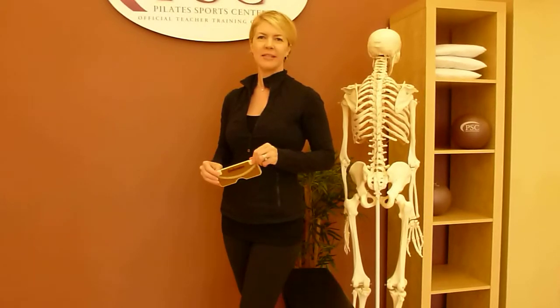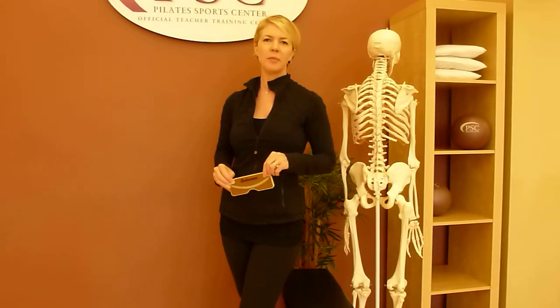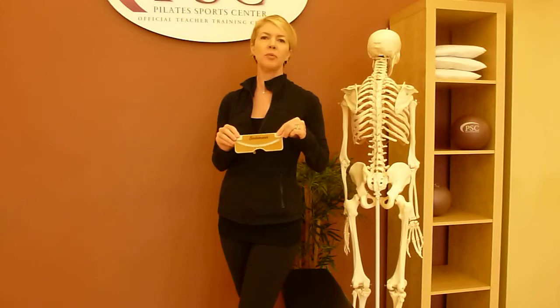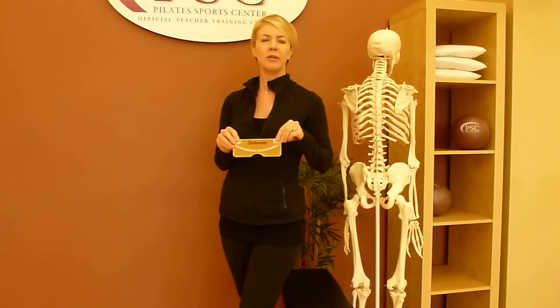Hi, I'm Andromeda Stevens, Doctor of Chiropractic with the Scoliosis Coach here at Pilates Sports Center in Los Angeles. We're going to demonstrate today how to use a scoliometer to measure the rotations in a scoliosis.